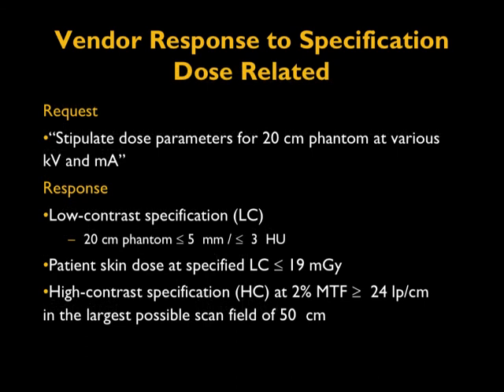Often the clinic can become very picky on a particular manufacturer and make the specification so tight that only one manufacturer meets it, and that's usually not a favorable way of doing a CT selection, and sometimes it can also be misleading.